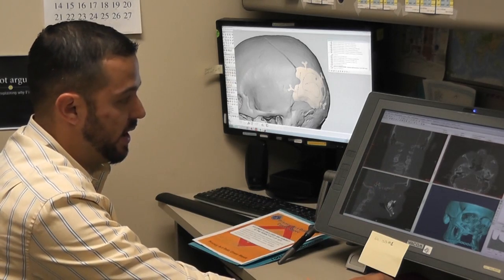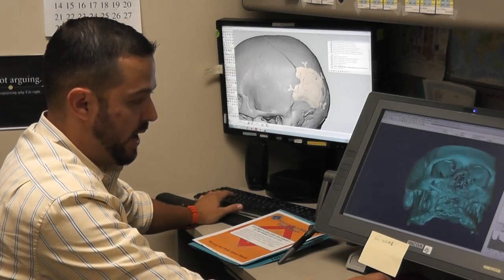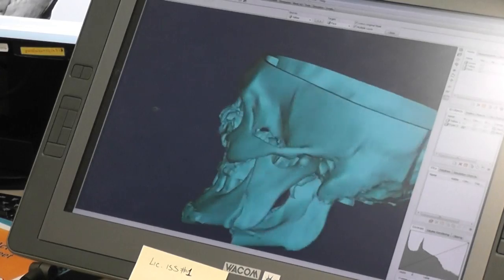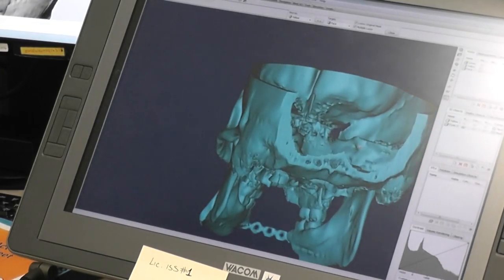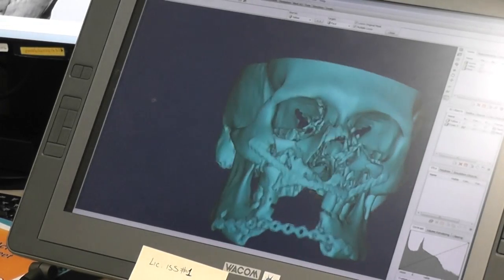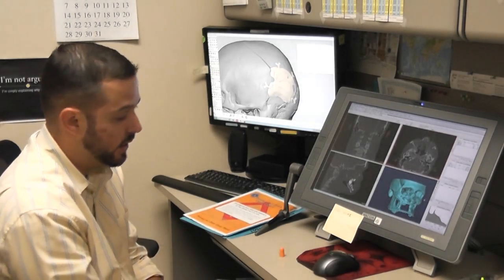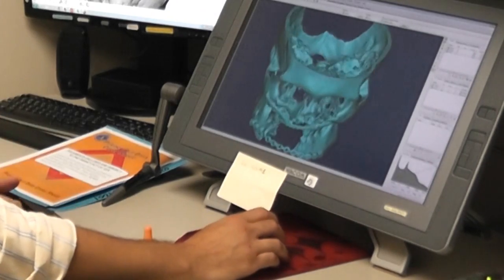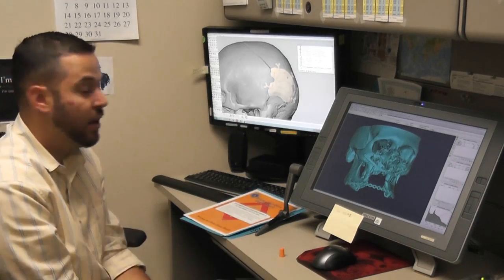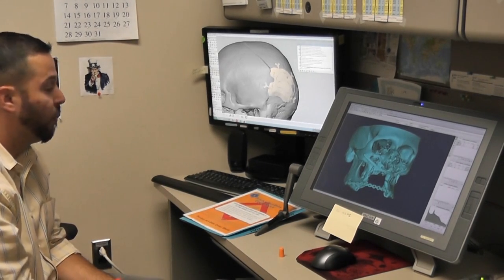In this particular case, we have a patient who had a pretty bad injury to his face. The patient has been repaired to an extent, but he's going to need more surgeries. Before the next surgery, the surgeon wants a model of the current state, which allows him to do a lot of pre-surgical planning. So in this model, I'm making a pre-surgical model — I'm not designing anything, just giving them what they have.